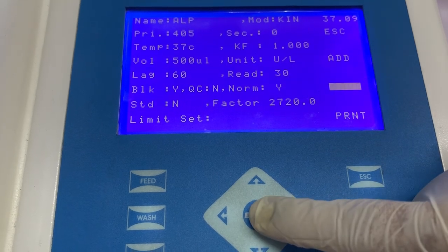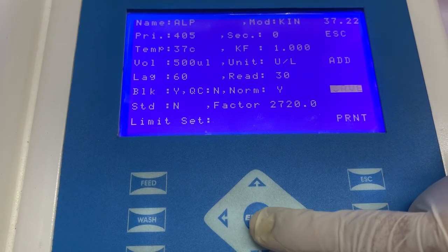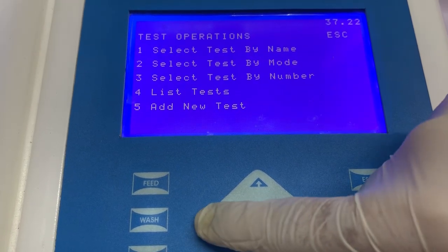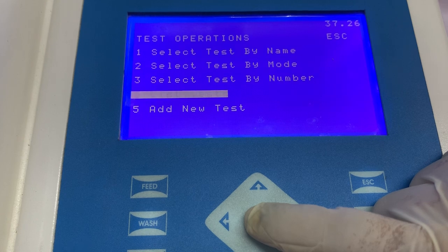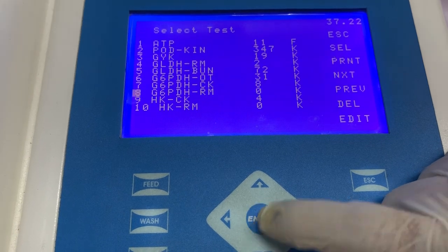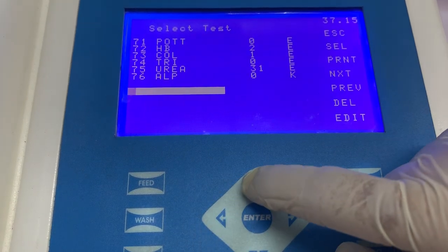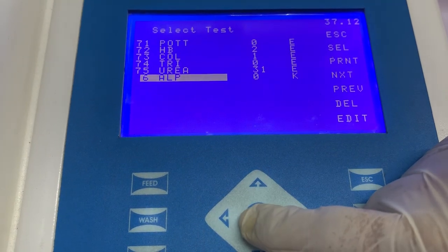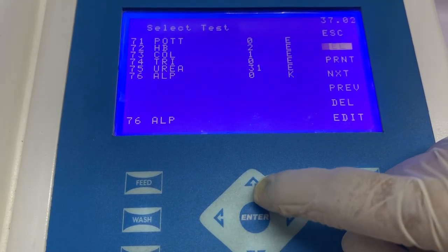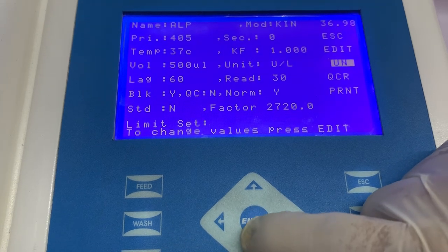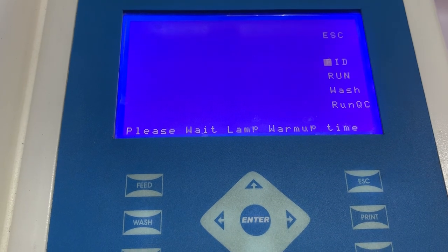Now, as you can see, whatever information is required to program the software has been added. To save the program, select the option save. Our program has now been saved in the software. To view the program, go to list test and go to the window where our program has been saved — in this video our program has been saved in position number 76. To open the program, select it. If you wish to run any patient sample, select the option run, and further the instrument will guide you on how to take the absorbance. Thank you, and we hope this video has been helpful for you.